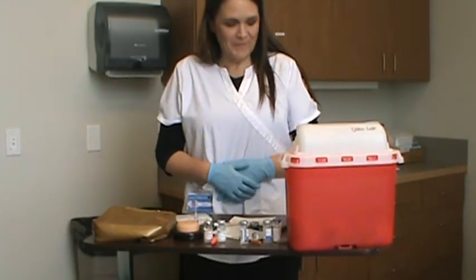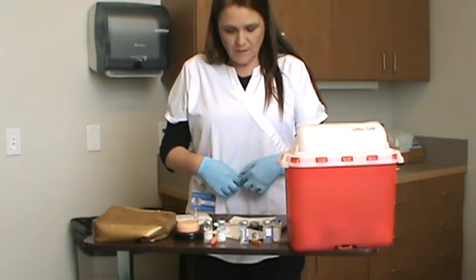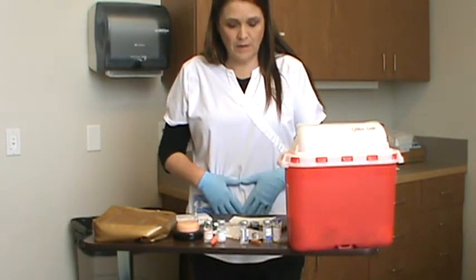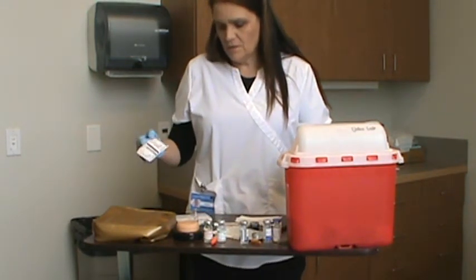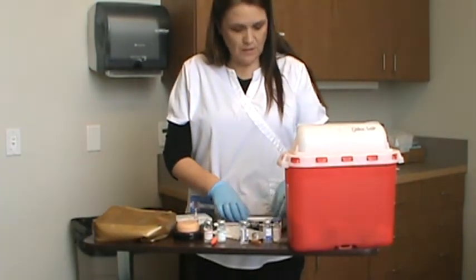Hers I would give in her abdomen, but I would stay about 2 inches away from her belly button. Give it around there. The size of the needles, you can use an 18 to 25 gauge syringe, and 1 to 1.5 inches in length.